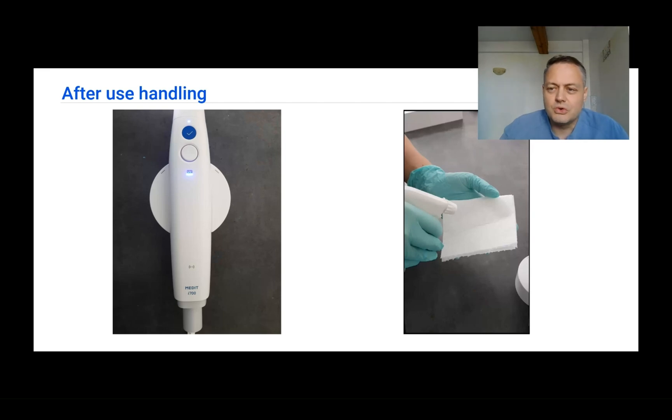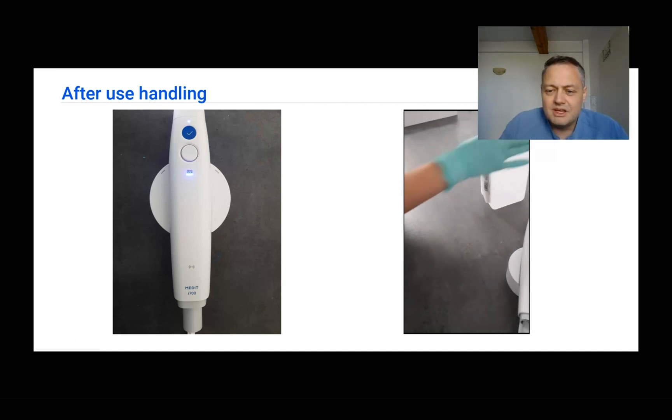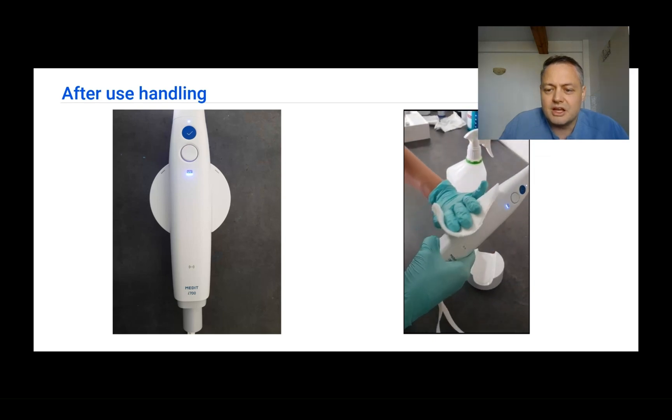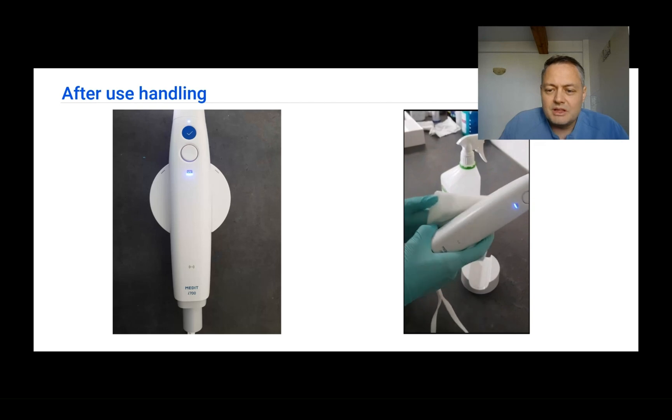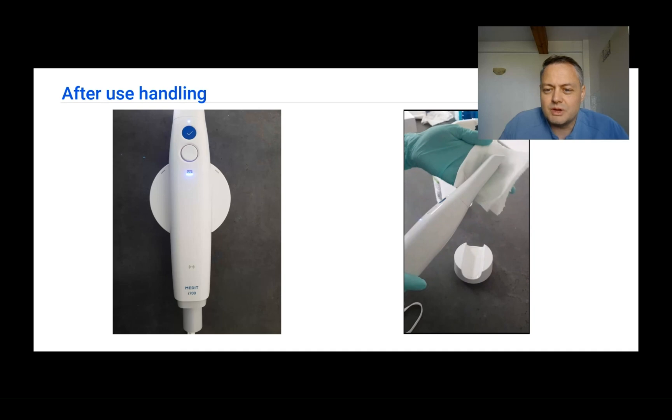The external disinfection process involves spraying a sterilization agent on a dry cloth and wiping the scanner down. Never spray the sterilizing agent directly on the scanner, as it can get inside and damage the device. Always spray onto a cloth or paper first, and then wipe the scanner off.